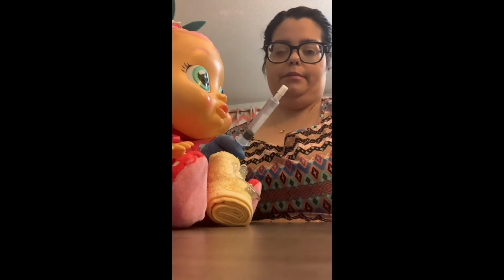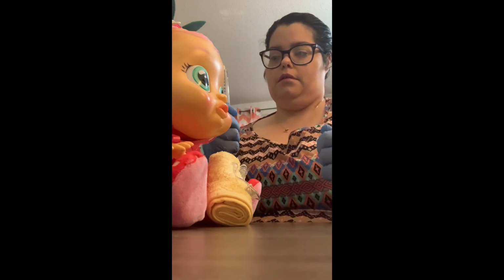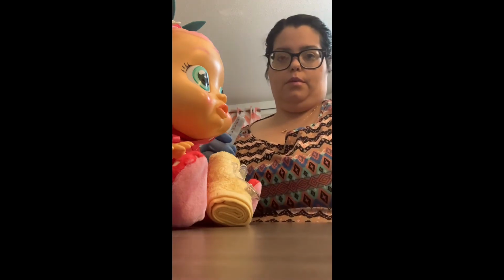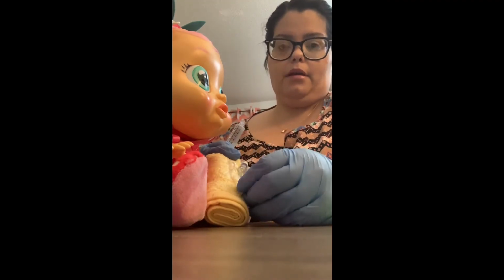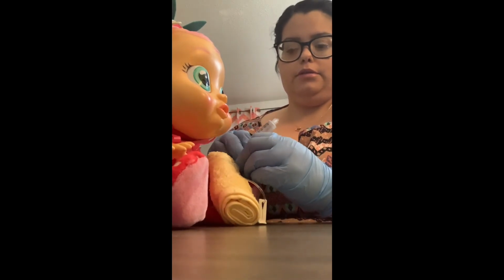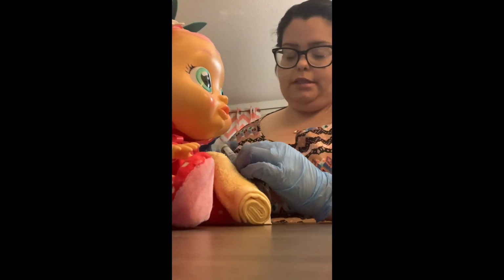syringe of normal saline. We're going to uncap it. We're going to break the seal. We want to clean the hub on the IV itself and make sure we are unclamping the IV. So we're going to clean the hub. The syringe in.